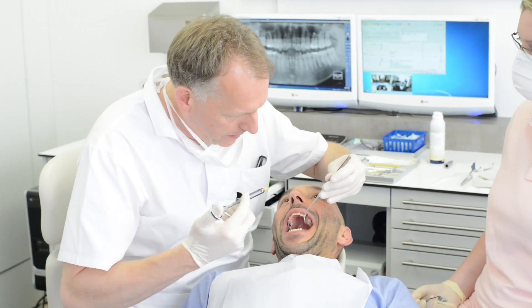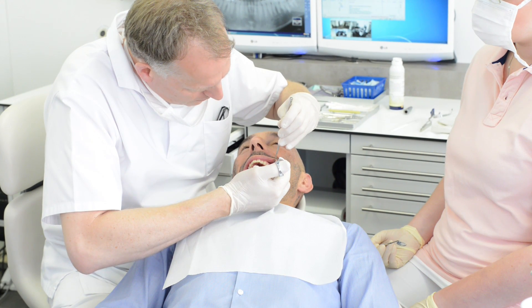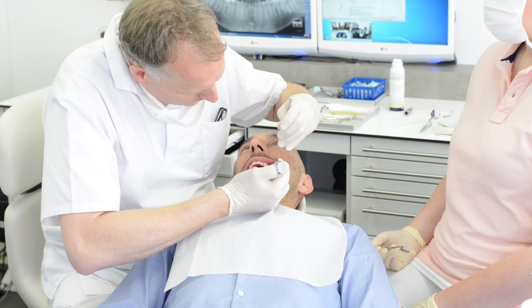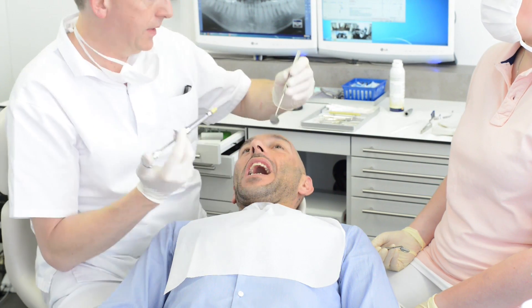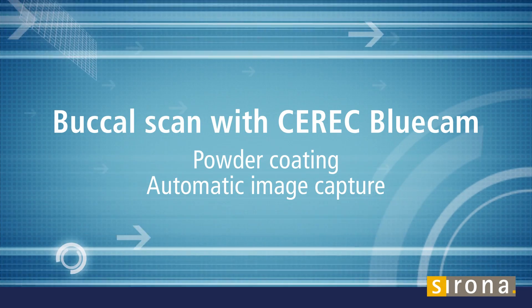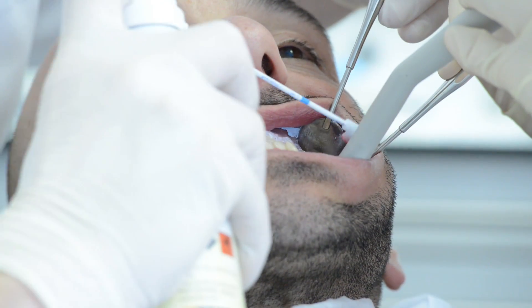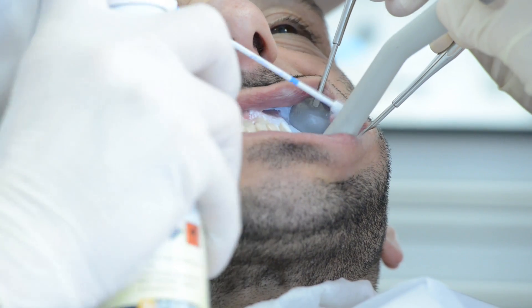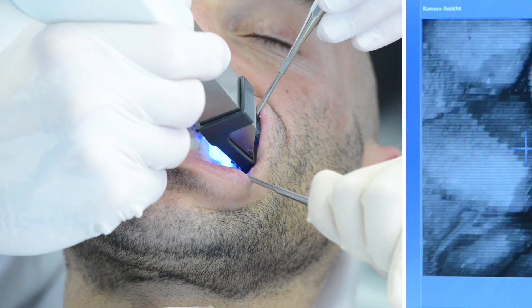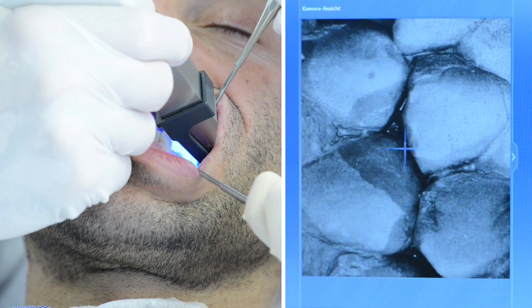While waiting for the injection to take effect and before the patient feels any numbness, we proceed with the buccal scan, highlighting the differences in basic use between the two cameras. The BlueCam requires powder as a contrast agent. The camera automatically detects the right moment to trigger the image, which results in a highly precise virtual 3D model.